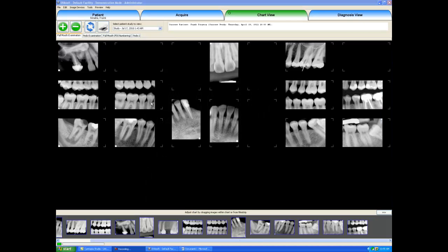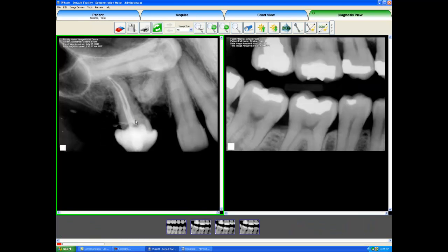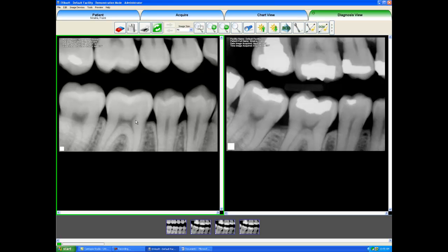The last right-click function to show you is in the Chart View. If I right-click and select Send Image on a chart position, it will show me every x-ray in that chart position historically for that patient. So for this current patient, Frank Sinatra, I have taken four bite wing shots on that one position. I can now click Diagnosis View and send those four x-rays to the Diagnosis View tab so I could look at a historic comparison for one x-ray position for that patient's history.